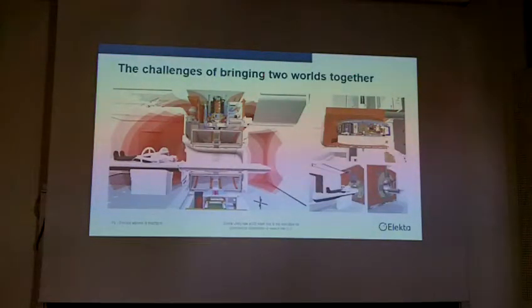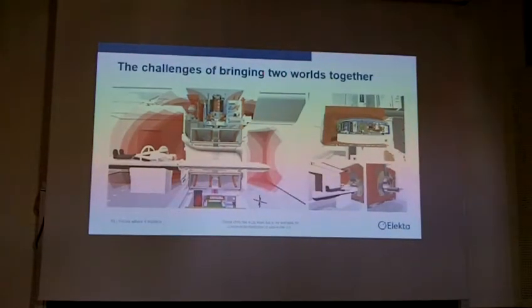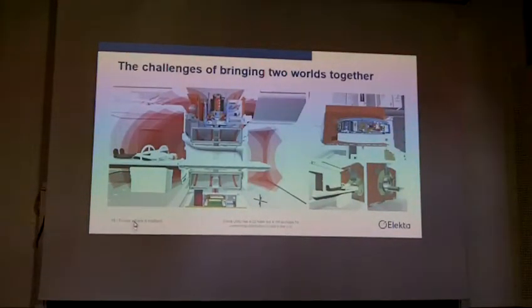The system has also a beam stopper, so with the beam stopper you don't need primary shielding, and in front of the beam stopper you have also an MV imaging device mounted, which is for calibration purposes. An MRI linac, so Unity, fits into a normal bunker.